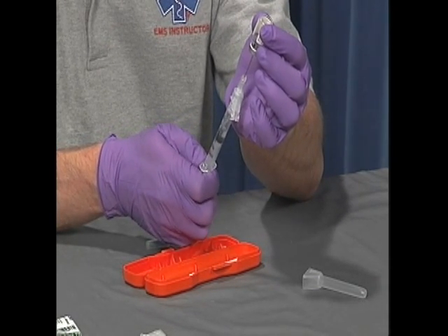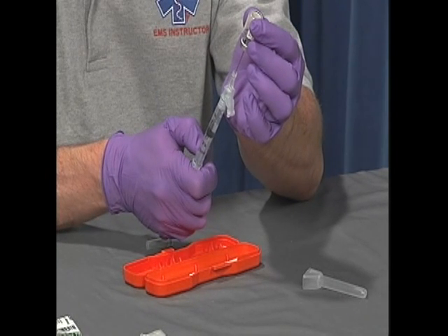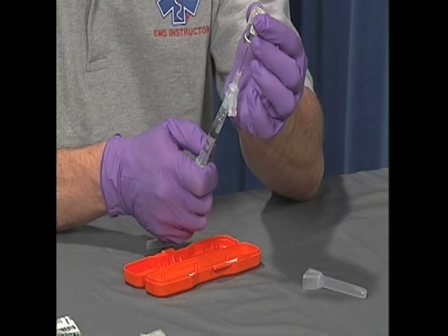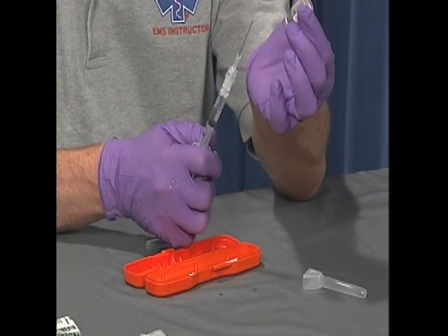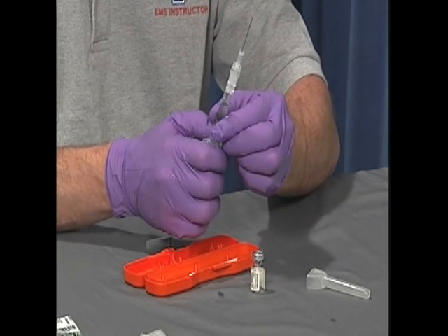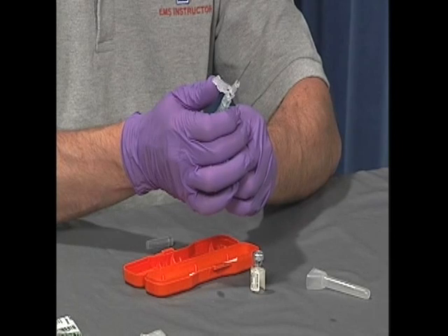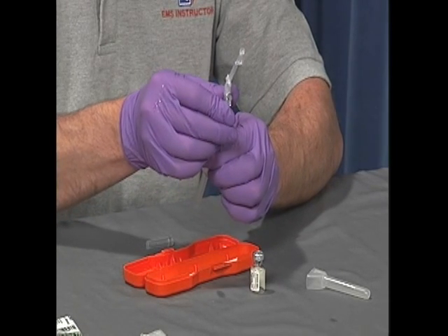Pull back gently on the plunger to draw the medication or diluting solution into the syringe. Withdraw the needle and syringe from the vial, utilizing the safety feature. Remove and place the sharps in a sharps container.